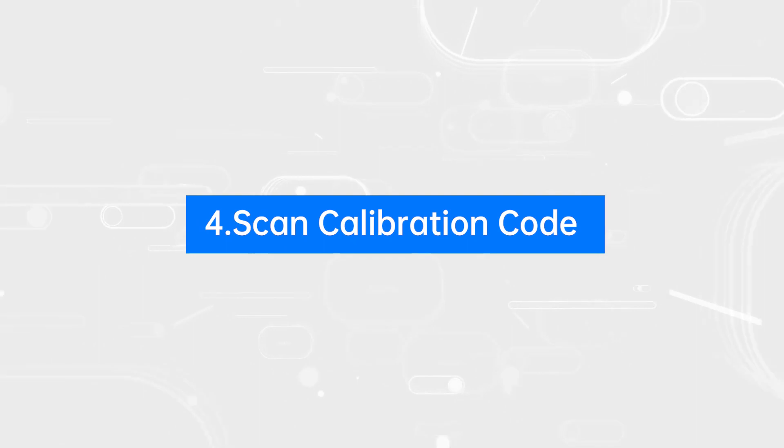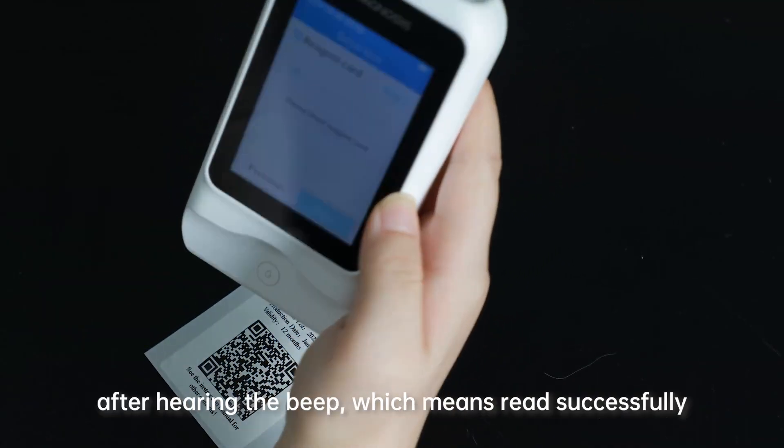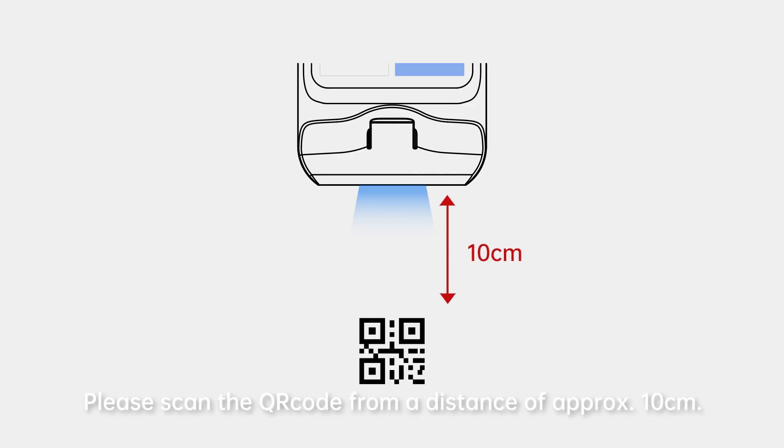Step 4: Scan Calibration Code. Scan the QR code on the test strip package. After hearing the beep, which means it was read successfully, the scan is complete. Please scan the QR code from a distance of approximately 10 cm.